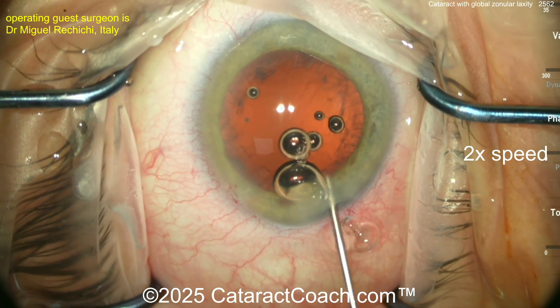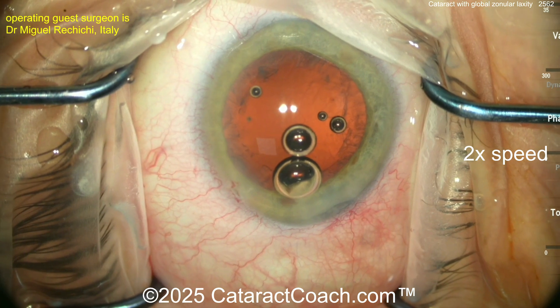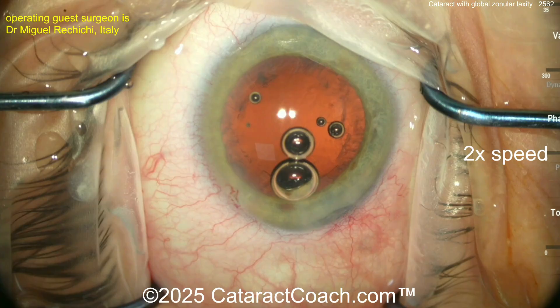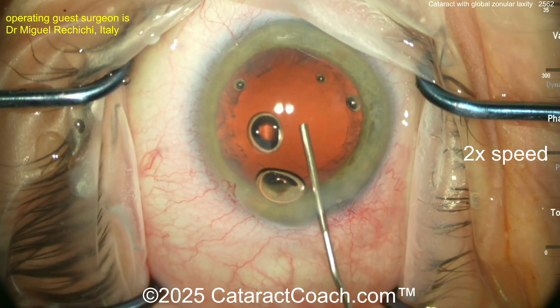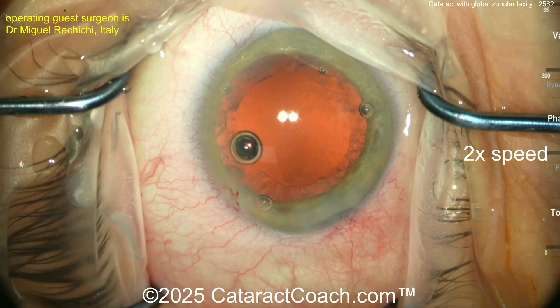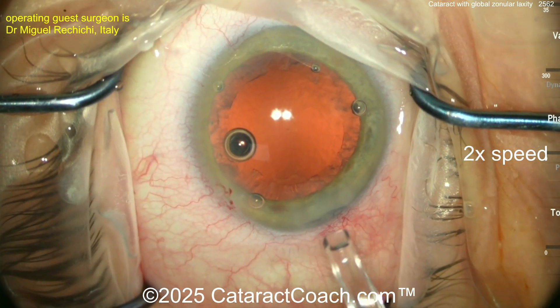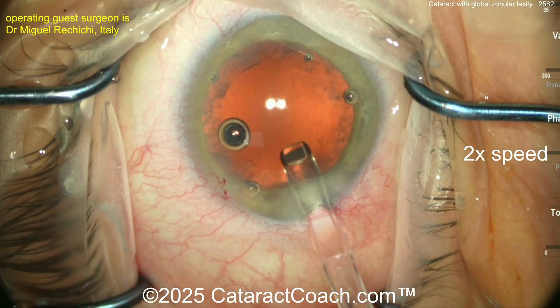You could use the viscoelastic to visco-dissect some of the cortex, and you could even just put the CTR in now. You can see you have a full view of the cornea at this point, but when you push the eye nasally it'll disappear under that plastic drape. So a little more viscoelastic, getting a good capsule bag filled. Here comes the CTR.